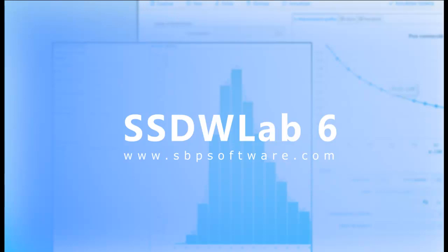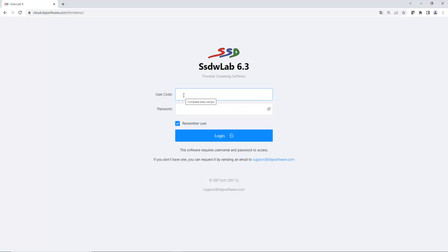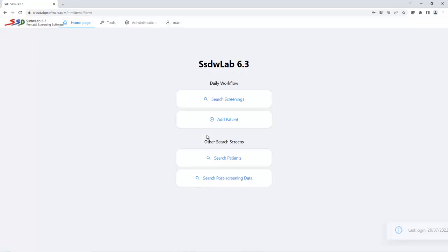Now we will see how to perform a screening of preeclampsia with SSDWLAB6. As usual, first of all, we enter the web program with our username and password. Once inside the program, several options are presented, and we choose the option Add Patient.